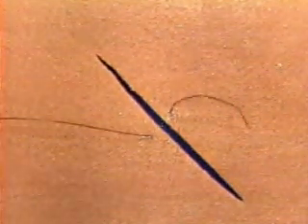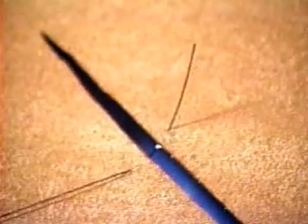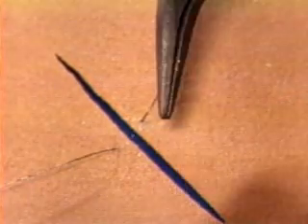Now for the second big trick. Before you start on Act 2, which is making the loop, you need to set yourself up so that you'll easily be able to perform Act 3, which is picking up the short end. Let's look at the potential difficulty. It's a matter of where the thread is pointing and where your forceps are pointing. The short end of the thread may be pointing north, south, east, or west, and it may be lying down flat or sticking up in the air. Your forceps also may be pointing in any direction.